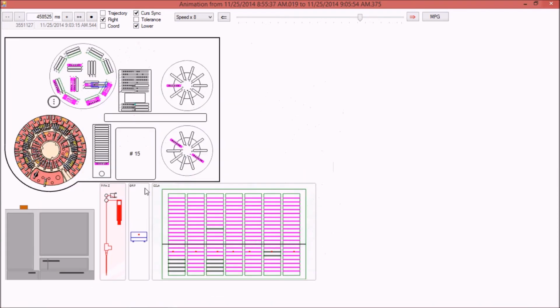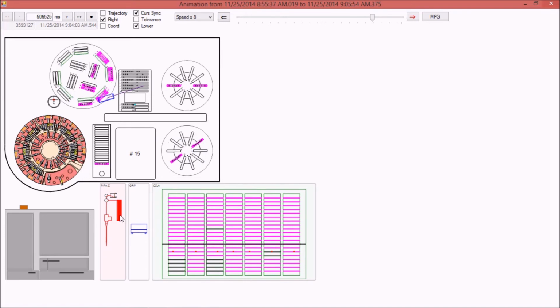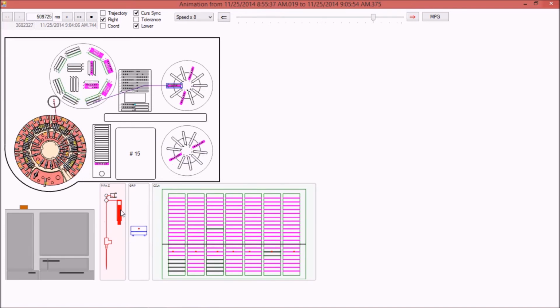Here is a symbolic representation of this drawer. This is the drawer, in this case featuring 7 columns, each of which is actually a structure containing these consumables. This is, for instance, the gripper, so the vertical move of the gripper. Now you can see that the gripper went down to place the card, the consumable, into the centrifuge. This other one is on the other side, the pipetter, that is composed by a needle, a probe that gets into one of these positions to get water or to get reagent or whatever. And this one is a diluter, so a precision syringe that moves a plunger to get and dispense precisely defined volumes of liquids.